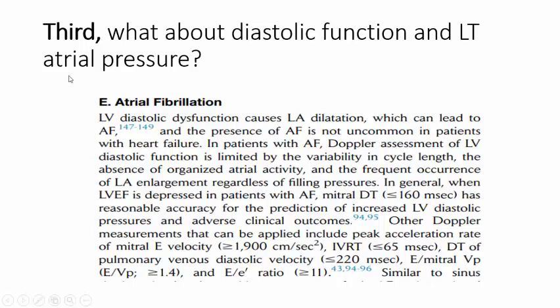Because the patient has AF, according to the American Society of Echocardiography and the European Association of Cardiovascular Imaging, I need to assess two things: the average E wave velocity over the average tissue E prime velocity. If more than or equal to 11, it goes with diastolic dysfunction and increased left atrial pressure. And I will assess the deceleration time of the mitral valve flow. If less than or equal to 160 milliseconds, that means there is diastolic dysfunction.